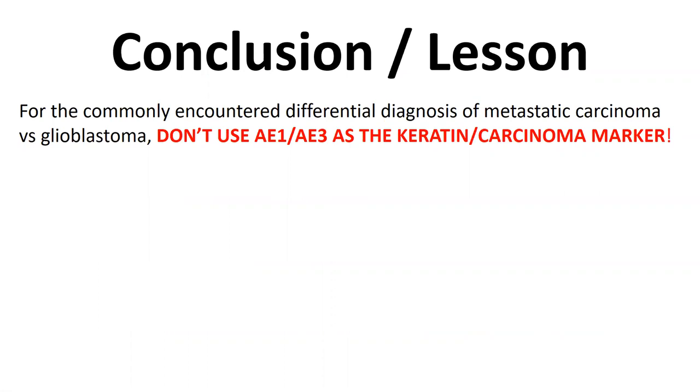Listen, everyone in this audience, all you guys are now ambassadors. You are ambassadors to spread this knowledge, spread the wisdom, and look, it's going to make it fun for you. If you did not know this, and you say you're a surgical pathology fellow or resident, watch for it. Watch for it in the cases coming through, right? Now, in many instances, it will be stone cold negative. They got lucky, right? In a glioblastoma, AE1, AE3, stone cold negative. It may not actually be as high as 80%, all of that. But the cases will come through, many of them frequently, where you see focal, strong, unequivocal staining.